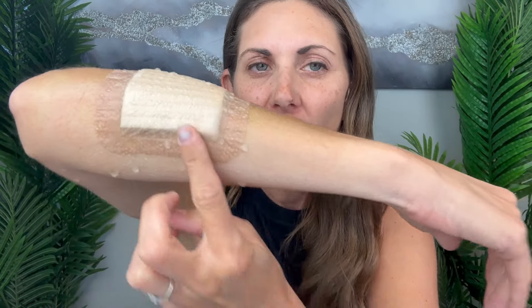I dried the rest of my arm, but you can still see how the water droplets have stayed on the outside of it. So I did get it totally wet. Let's go ahead and take it off.